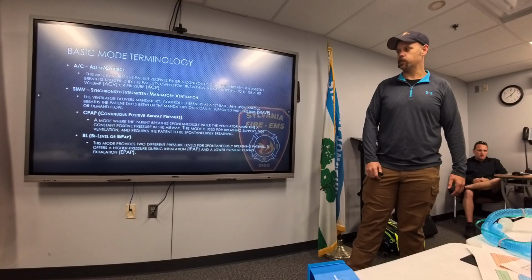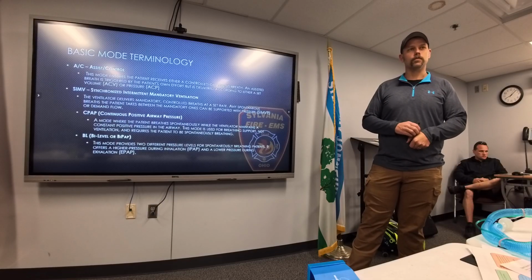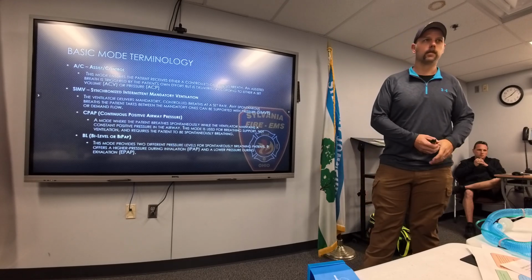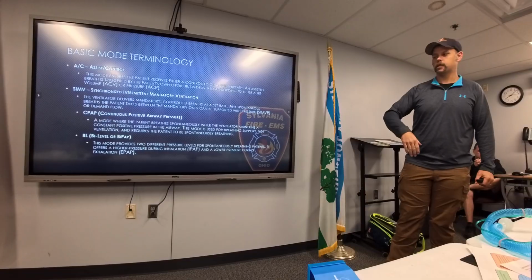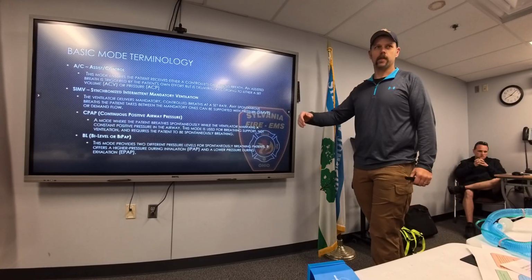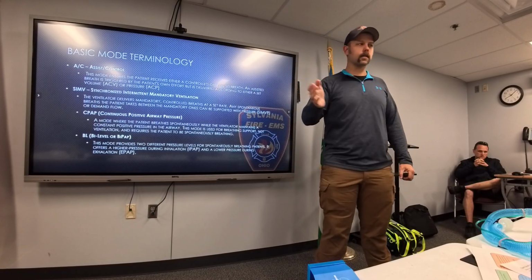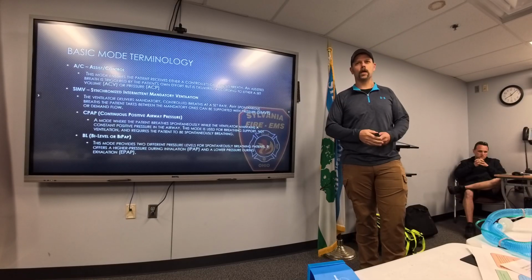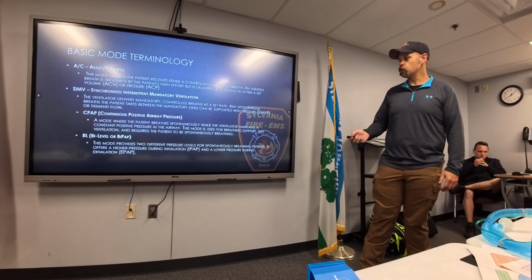We should all know what CPAP is by now. BiPAP or bi-level, those two words are used interchangeably. This mode provides two different pressures. You have an inspiratory pressure, which we refer to as the IPAP, and an expiratory pressure, the EPAP. So think of it as you get a higher pressure when you take a breath in, and then when the patient exhales, there's still pressure there, maintaining PEEP, but it's at a much lower pressure. So instead of just that one constant pressure, we get two pressures.